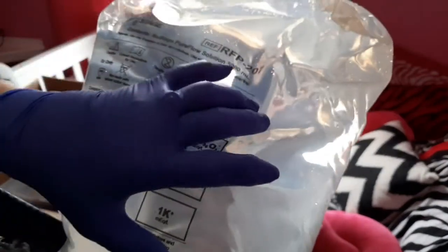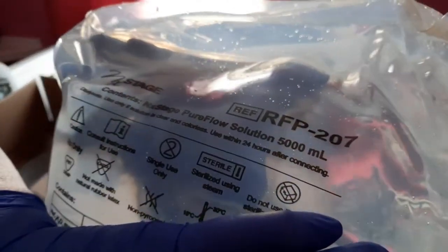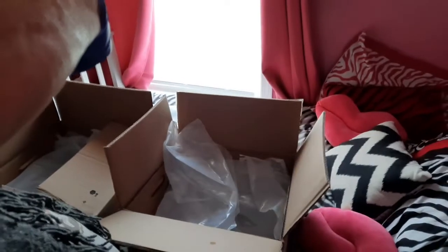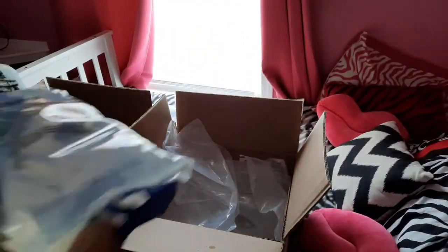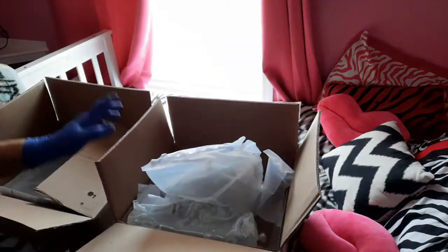All right, so I'm checking. It says 5,000 milliliters on here, see? And the date's on the bottom. It says January 1st, 2022, my bad. Okay, this one is good. Let me open the next one. I'm going to open them all up and then we'll move on to hanging them.